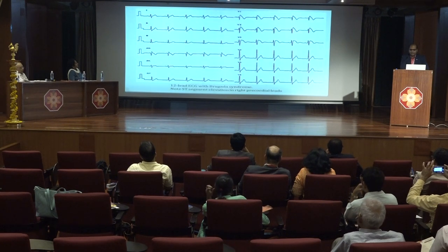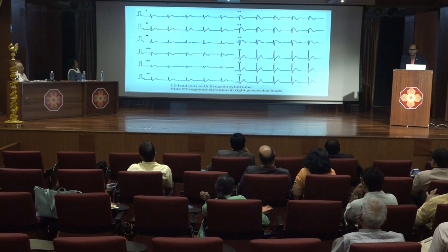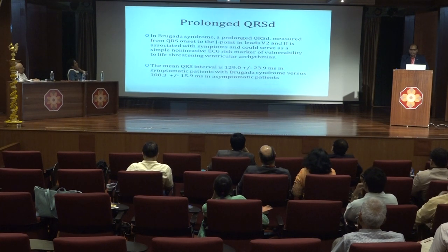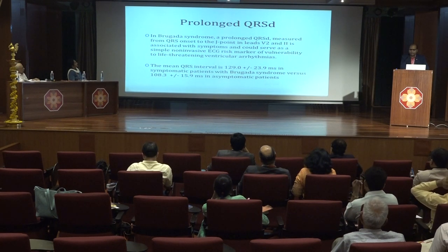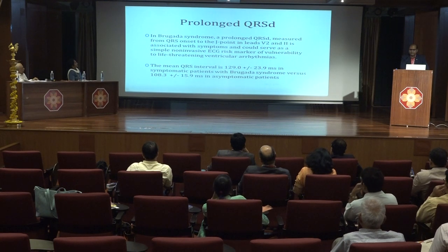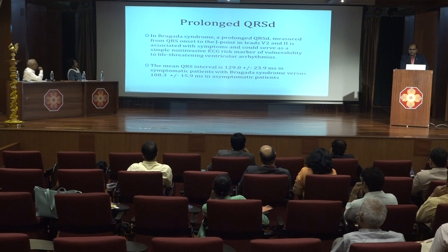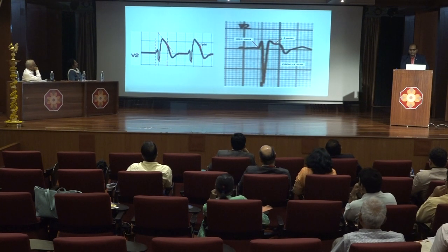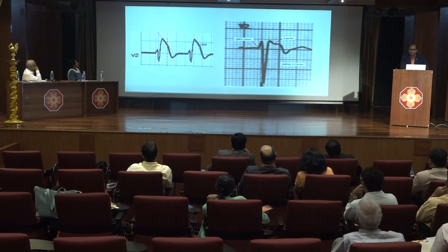This ECG from a type 1 Brugada syndrome patient shows coved ST segment elevation in leads V1, V2, and V3. In symptomatic patients, QRS duration is longer, averaging around 130 milliseconds, compared to asymptomatic patients where it averages around 108 milliseconds. Prolonged QRS duration is a marker for life-threatening ventricular arrhythmia in Brugada syndrome. QRS duration is measured from the start of the Q wave to the J point.